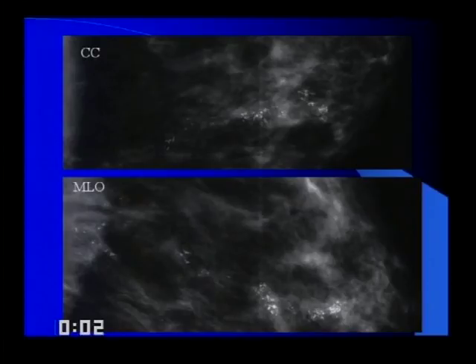I mean, what we want to know is if all of these calcifications are cancer. Because if they're all cancer, what does she need? If they're all cancer, what's the treatment? Well, you have to remove it. Our institution, we try to conserve the breast. Okay. If all of these were malignant, she would definitely need a mastectomy. So what we're going to do is biopsy the most anterior group and the most posterior group. And if they both come back cancer, then she is not a candidate for breast conservation because it's over 4 centimeters worth of cancer. And this was 7 centimeters from here to here.